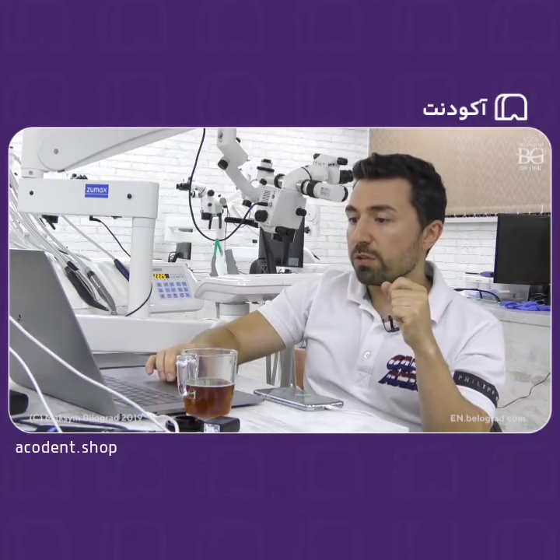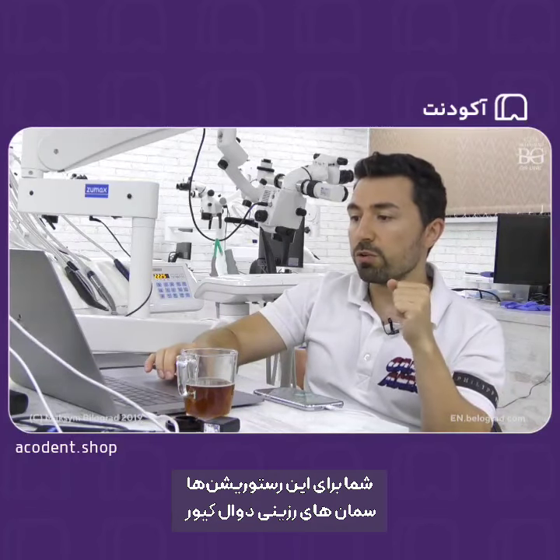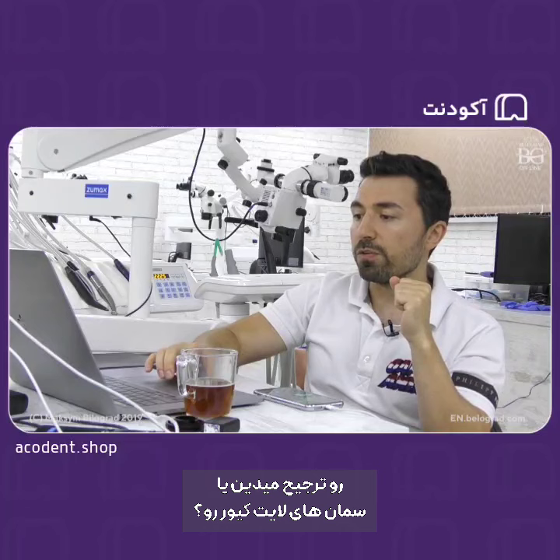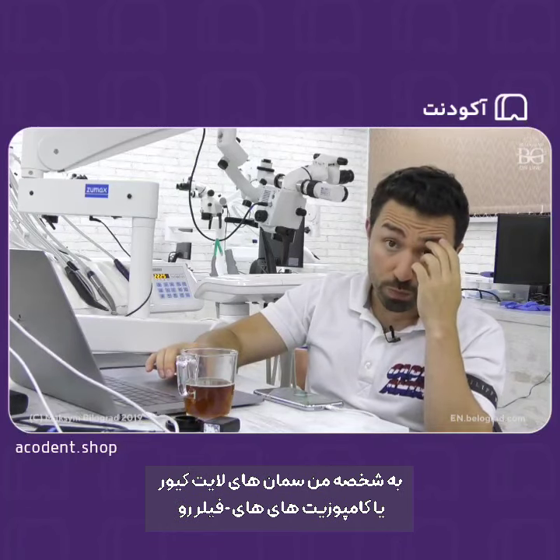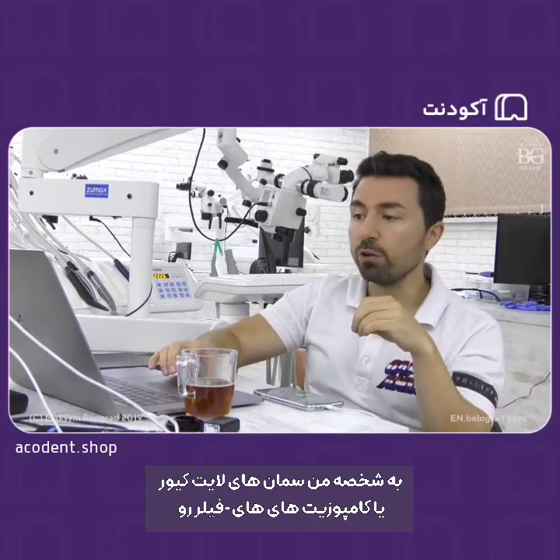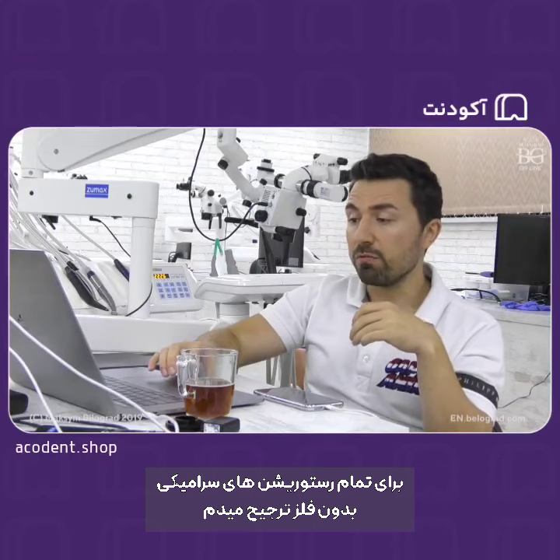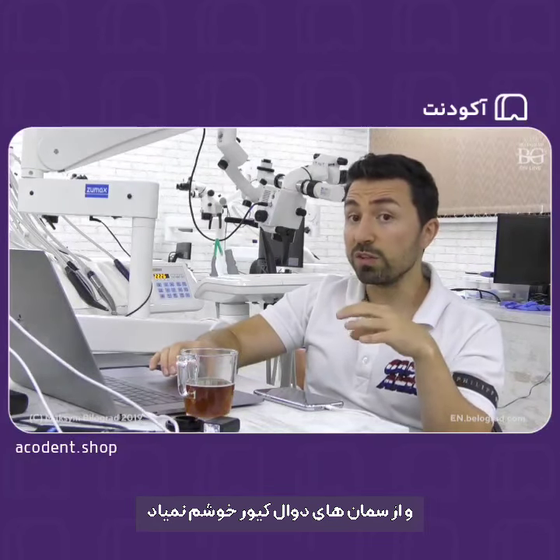Okay, another question from Dr. Tran. Do you prefer dual cure resin cement to light cure for these restorations? Personally, I do prefer to use light cure cements or highly filled composites to cement all of my metal-free ceramic restorations. I don't like to work with dual cure cements.